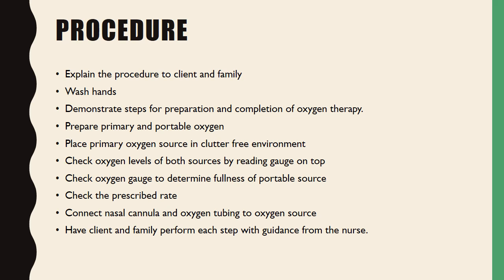Check the prescribed rate, that is, how much the doctor has prescribed. Connect the nasal cannula and oxygen tubing to the oxygen source, whether it is a cylinder or portable oxygen, wherever we have to get the oxygen from. Then have the client and family perform each step with guidance from the nurse. Once the nurse has demonstrated all the steps, next time the client or the family members can perform each step under the guidance of the nurse. So this is about the procedure of home oxygen therapy. Thank you.